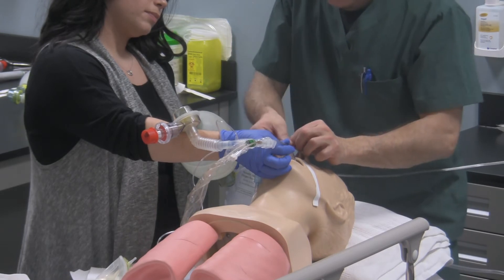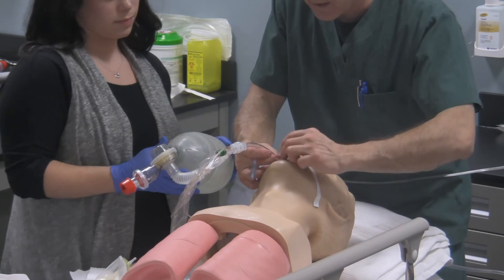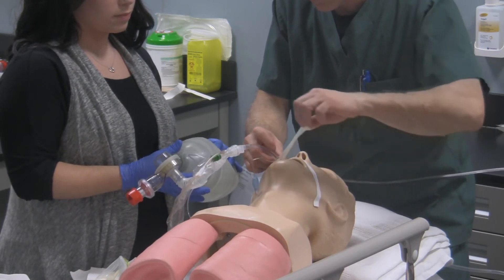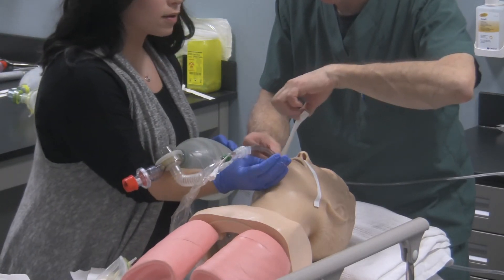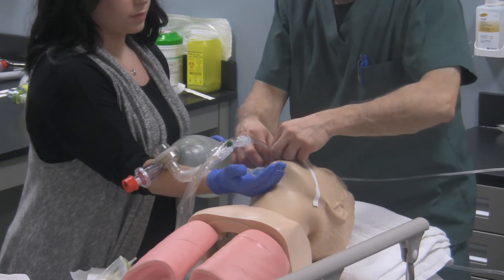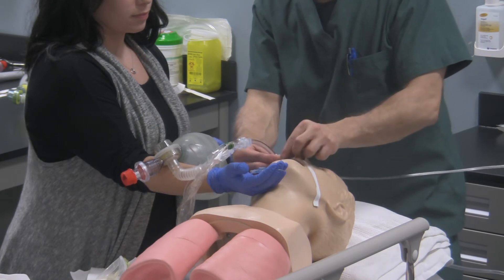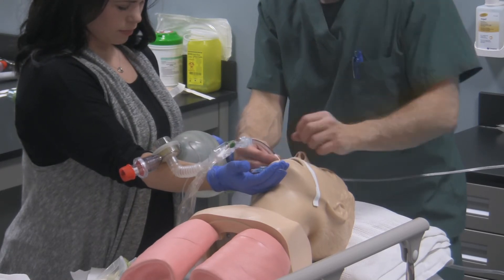I'm going to take the tube from Brittany — Brittany, I've got the tube. I'm going to bring it over to the corner of the patient's mouth and secure the tape to the tube, wrapping the tape around the tube a few times without letting go of the endotracheal tube. I'm going to take that pilot balloon line out of the way. There's a lot of tape here, so I'm going to simply tear that, get rid of this excess, and make a new tab.